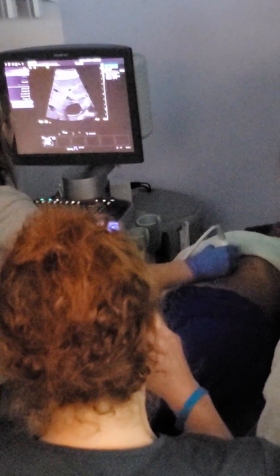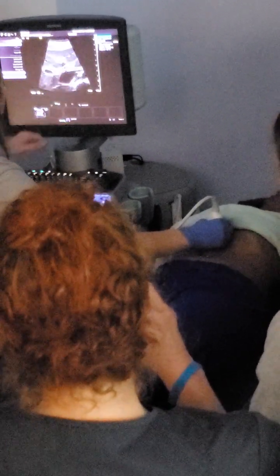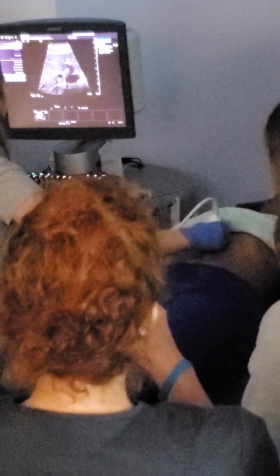So we did one for neck. We're going to do another for body. So I'm coming in again. So we're at the dome of the liver, coming inferiorly, main portal vein. We're just going to walk down that main portal vein. There's our neck. We're going to cruise down, get somewhere in the body. Now, am I oblique?